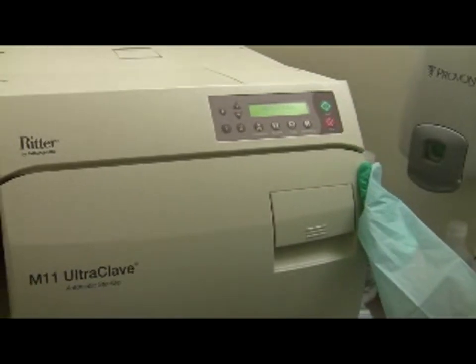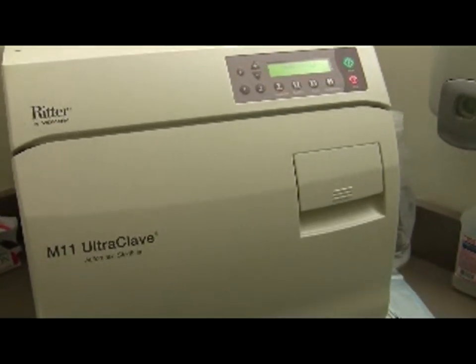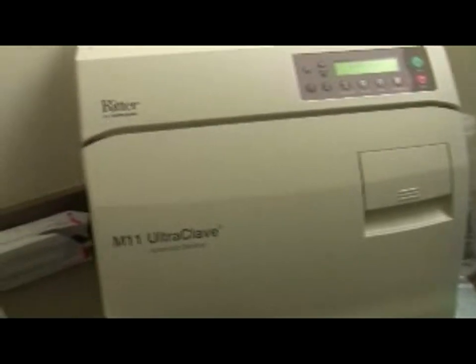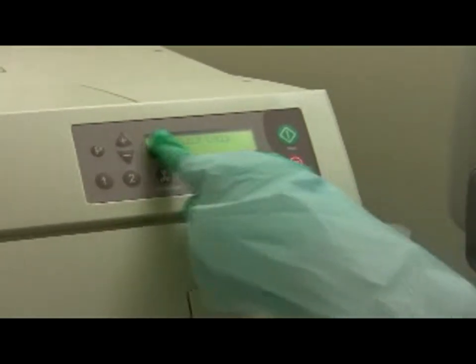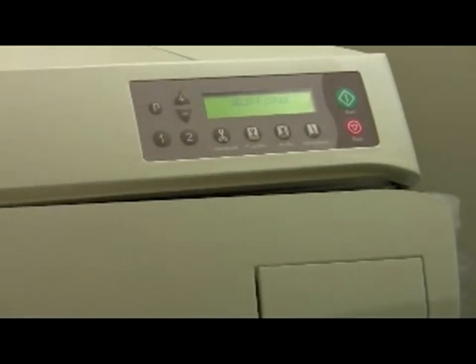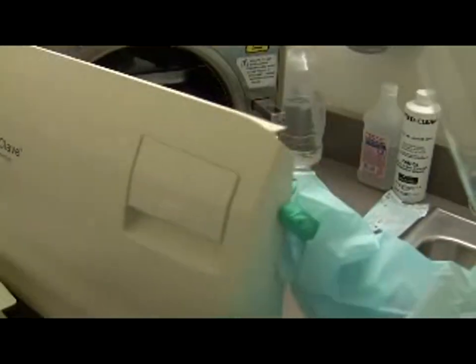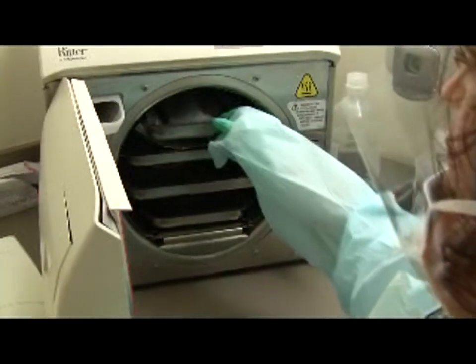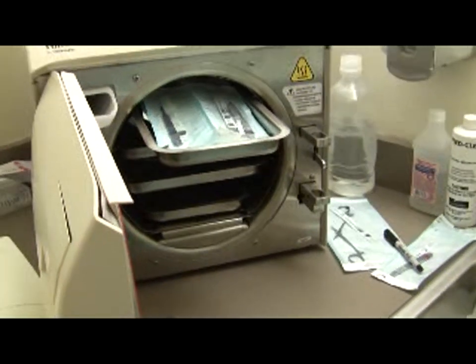If everything is okay, the digital indicator at the top should say 'filling.' If something is wrong, it will read 'error' — in case of error, call the company to troubleshoot. The autoclave manual is in the drawer below the machine. The cycle is complete when it reads 'complete' on the readout and the door goes slightly ajar to let steam out. Instruments are left to cool overnight.